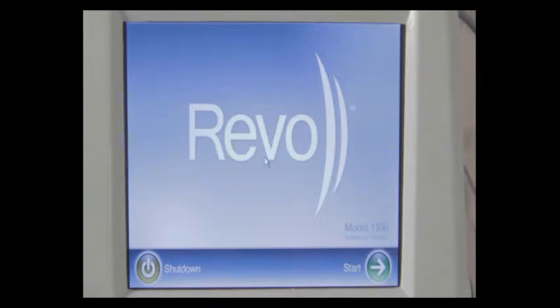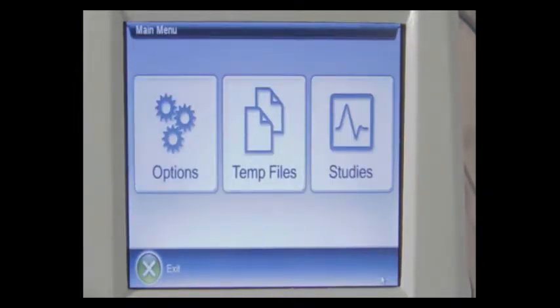We're going to discuss the REVO screens and operation. When you turn your REVO instrument on, you will come up to the REVO start screen. From here, we have the shutdown button and the start button. The first screen after starting is the REVO main screen. We have a button for options, a button for temporary files, and a button for studies — very much like our Multilab LHS and 2CP instruments.